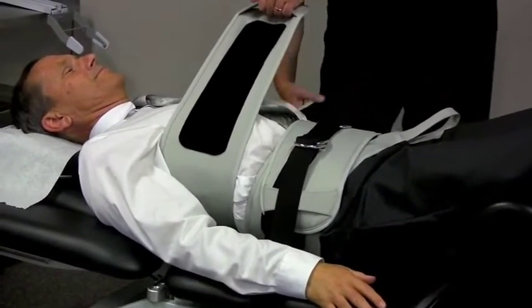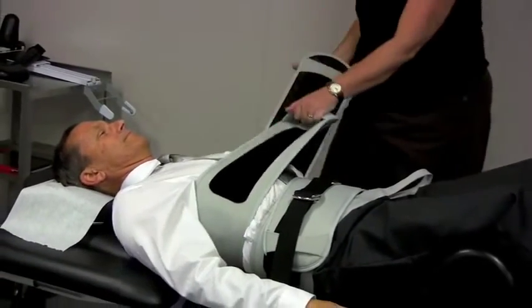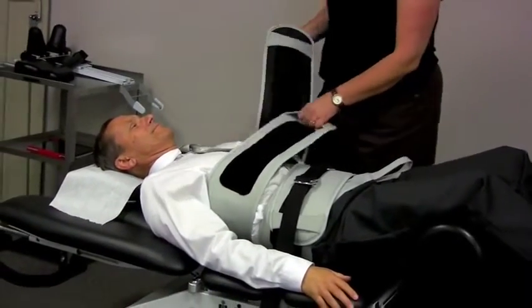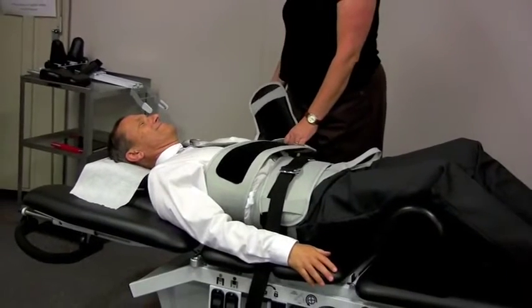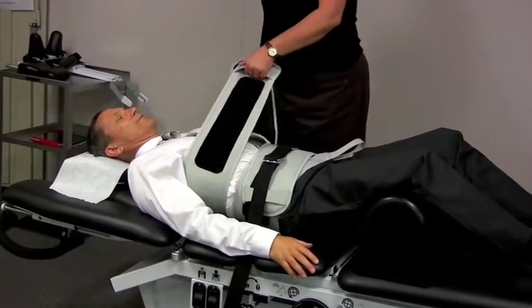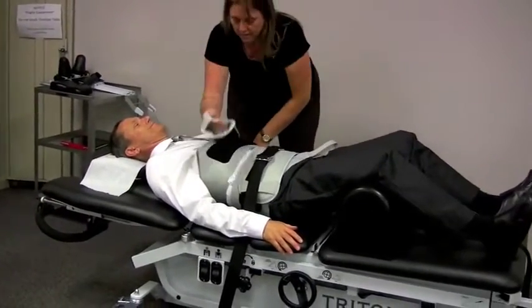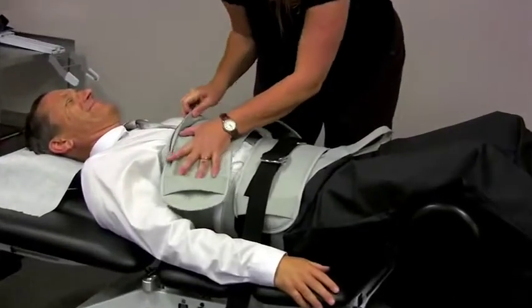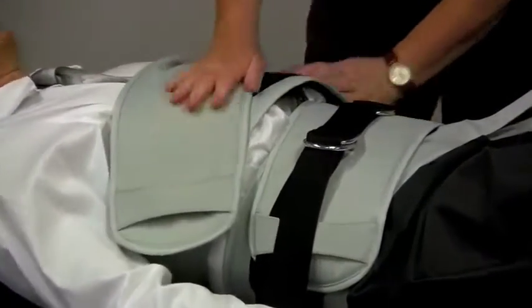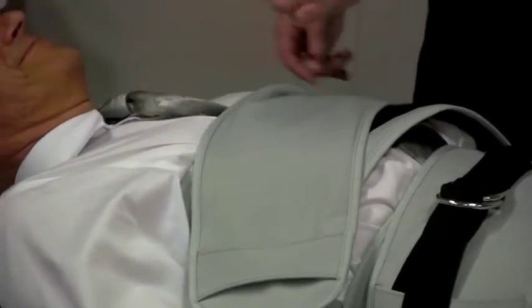This next part, I need to, again, Velcro these, but I need to pull in a diagonal and then push across. This one, you need to breathe all the way out first. So breathe in, breathe out. And the idea is you want this to be very snug. Does that feel very snug? Yeah. Can you still breathe though? Just going to tie a little bit.